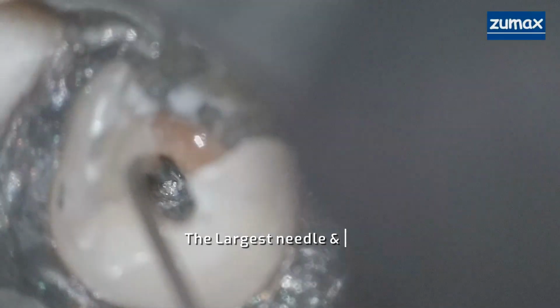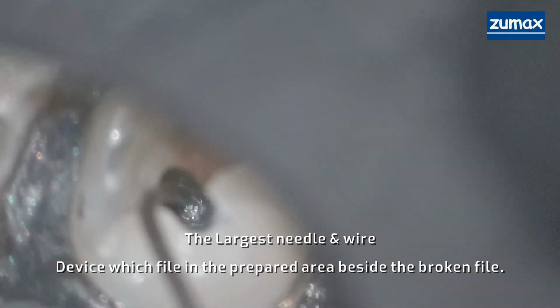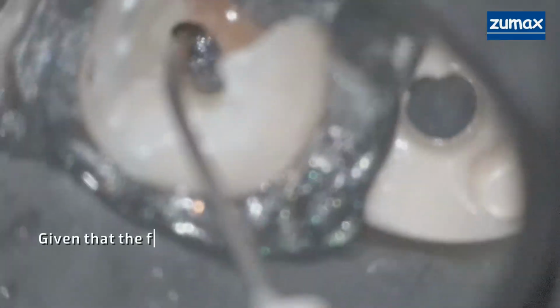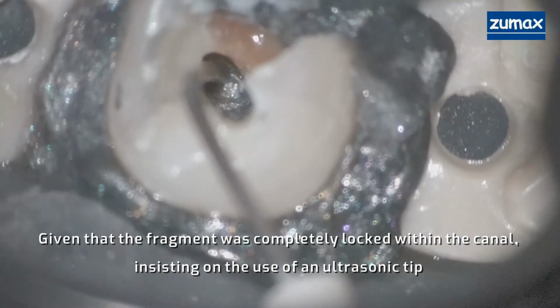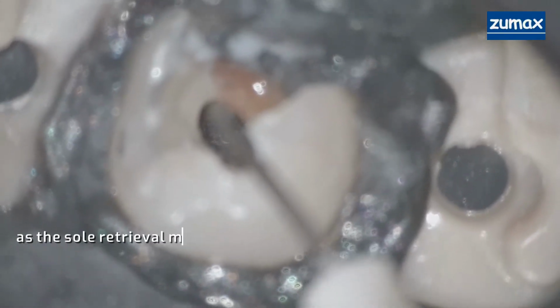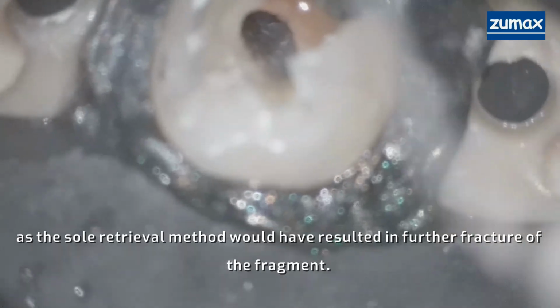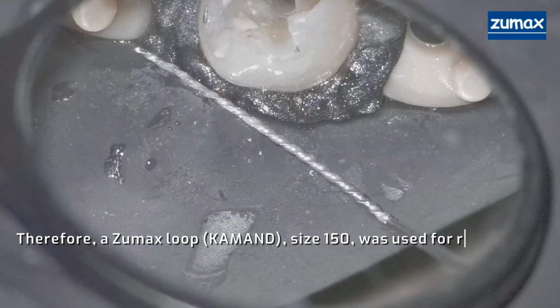The largest needle and wire device which fits in the prepared area beside the broken file. Given that the fragment was completely locked within the canal, insisting on the use of an ultrasonic tip as the sole retrieval method would have resulted in further fracture of the fragment. Therefore, a Zumax loop, size 150, was used for retrieval of the fragment.